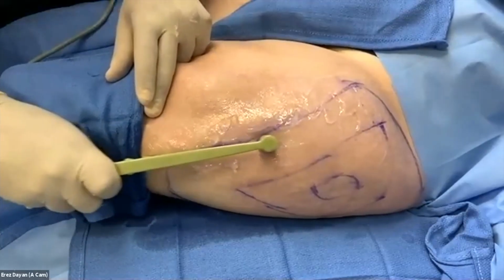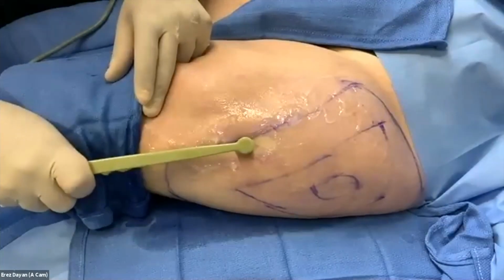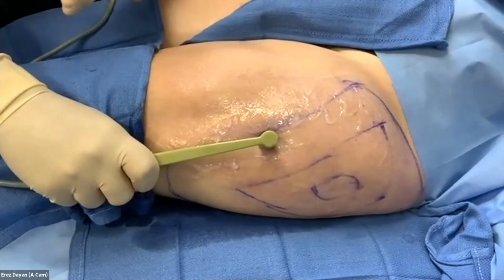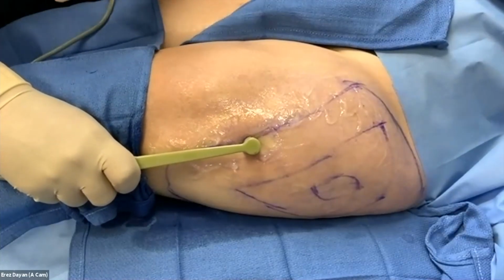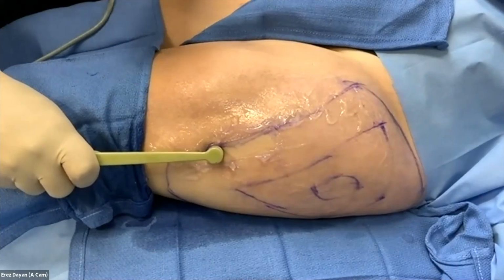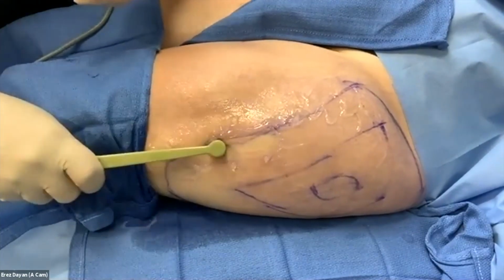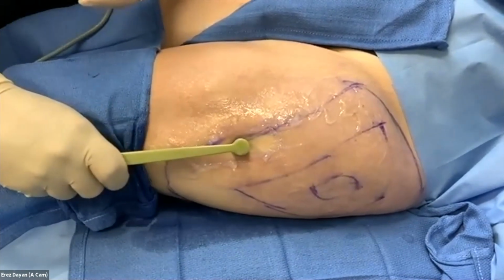And as you get more comfortable, you can go a little faster and make sure you're heating that whole row sufficiently. And you want to put a little pressure. You don't need to crunch on it too hard, but you kind of want to make sure you're volumetrically heating those fibroseptal networks, and you're getting that whole area hitting internal and external temperature. Now, usually once I hit the internal and external temperature, I kind of stay there for about 45 seconds to 60 seconds to make sure that I'm getting a good even heating.